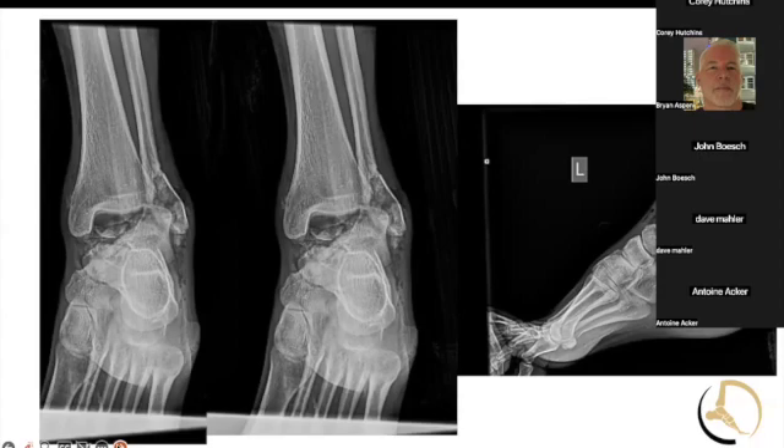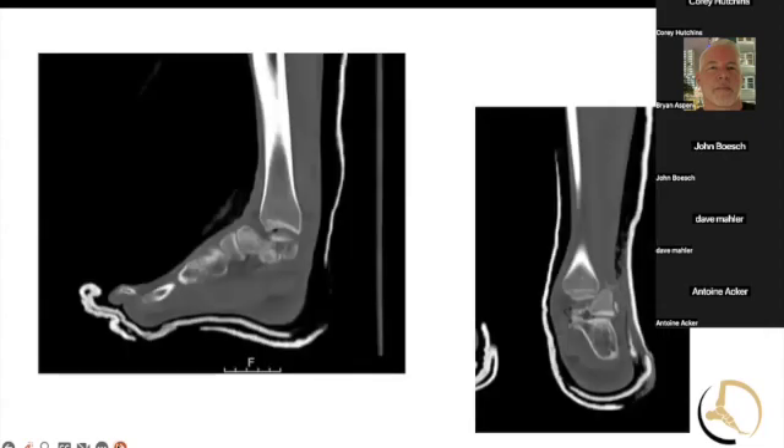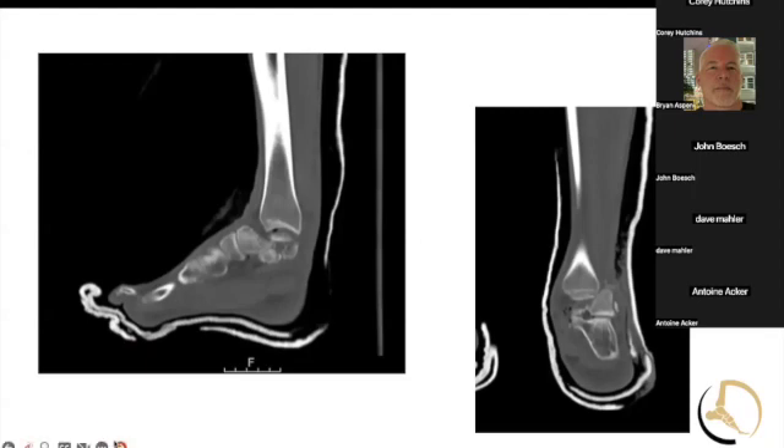Obviously a very severe ankle fracture, talar body fracture. You can tell that this probably is open, and this is his other side — calcaneus, talus, all look bad. A couple of views: you can see on the left side that the body of the talus looks crushed. Absolutely crushed.